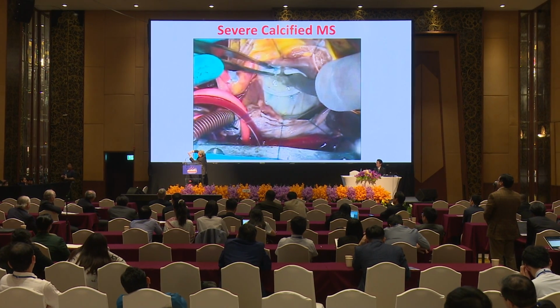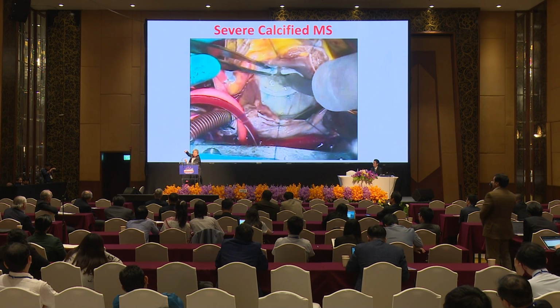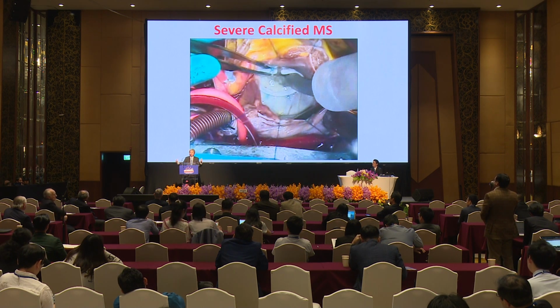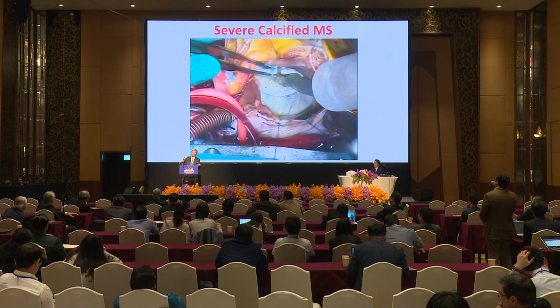It's drawn down, tip up, and then the coaptation is not good. Until we cut it back, it springs up, then we restore it down. Then it will be a very good buffer for the coaptation. Based on this, we are not reluctant to cut it. We rely on the improvement of coaptation.